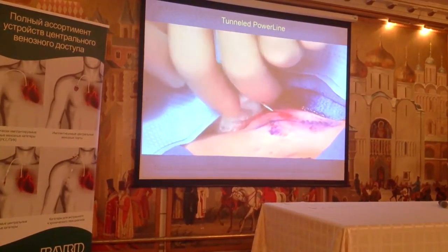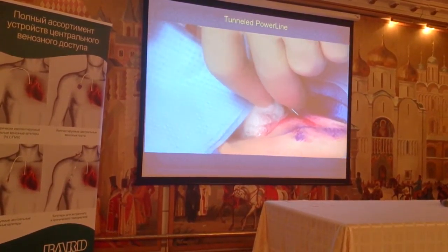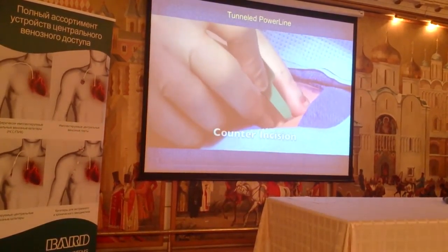There's the needle right in the vein. Aspirate blood, make sure we've got good flow and it's not arterial. Pass the wire and remove the needle.